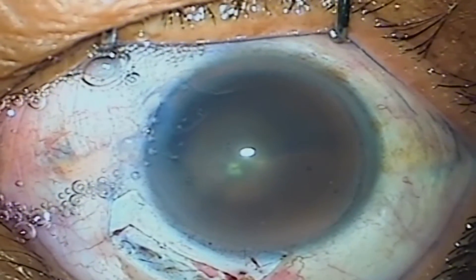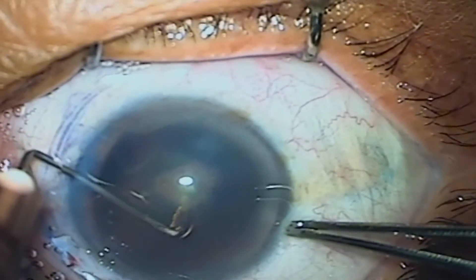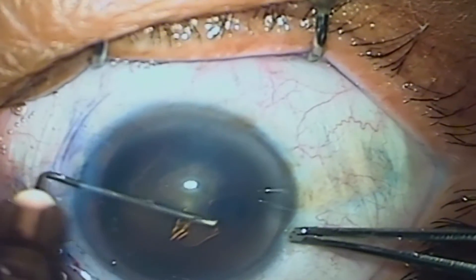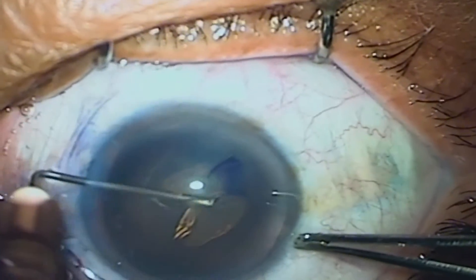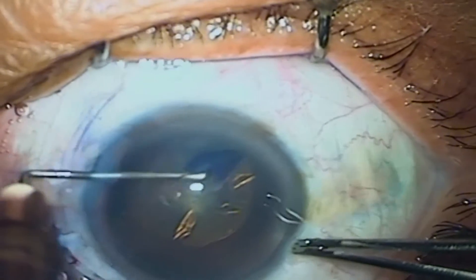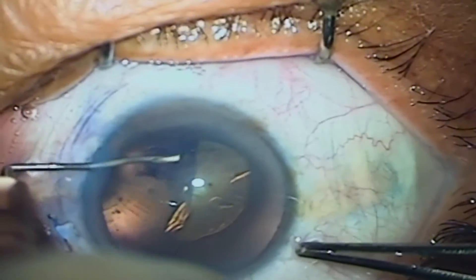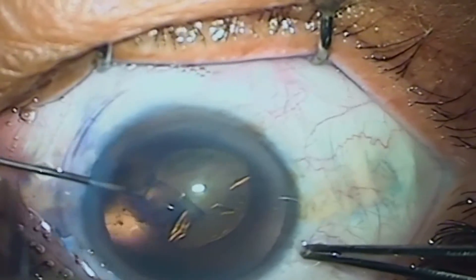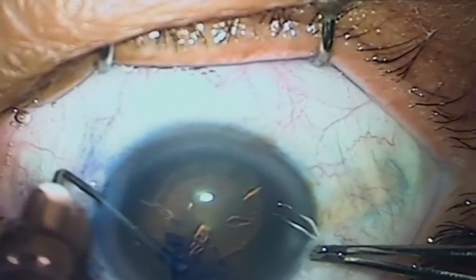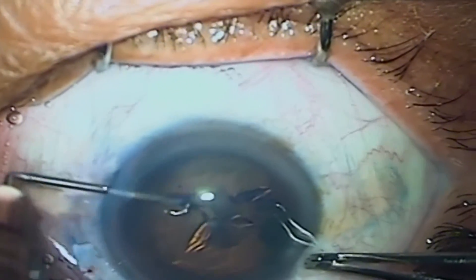Number three: keep an adequate rhexis size. This will prevent many complications pertaining to a soft cataract. The ease of prolapse of the lens matter is good, there is no fluid entrapment, and no capsular blowout. One can make an oval rhexis as well. In this case, in spite of a good rhexis, the soft lens matter denied to engage in prolapse, so nucleus tumbling again came to the rescue — which is safer to perform than to fiddle with lens matter in the bag. Note that there should be an adequate rhexis before you perform this maneuver.